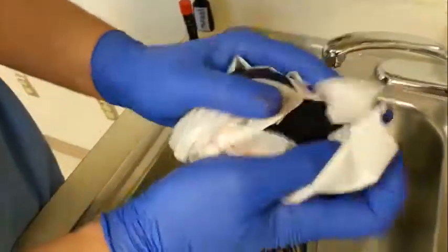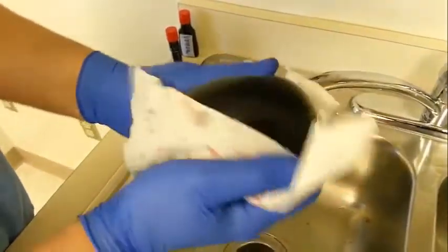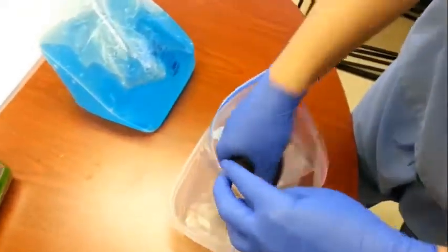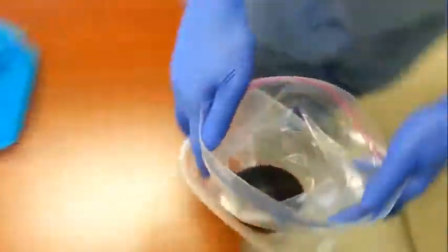Dry it off to make sure any residual red food coloring is off the outside. Then place your whole setup into the balloon.